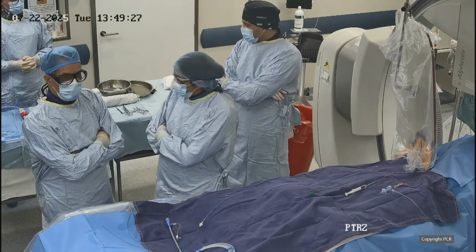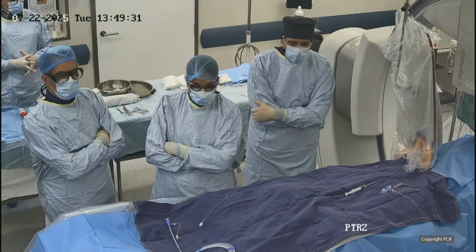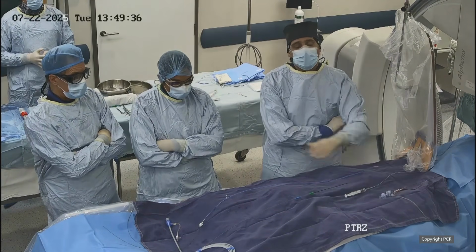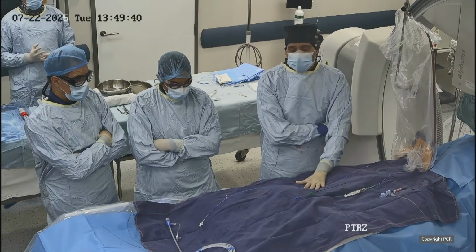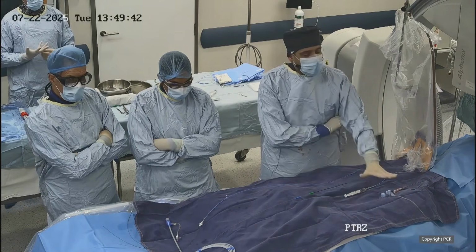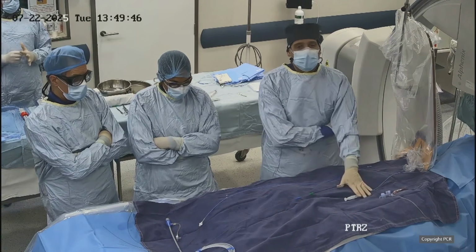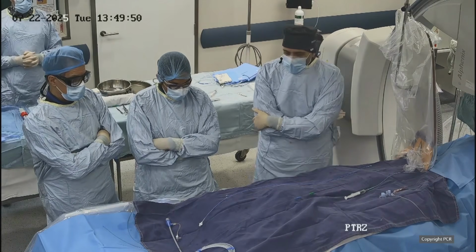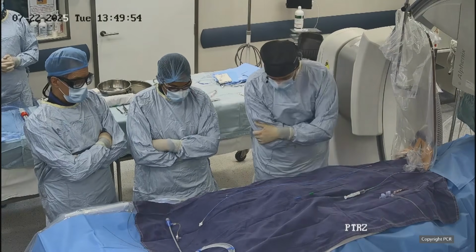And well, the setting that we have today is we have two left groin access and one right that is going to be for the valve deployment. The two in the left, one is for the pulmonary artery and the other is going to be for the left hepatic vein. So we have the catheter in place. We are going to show you the setting now.